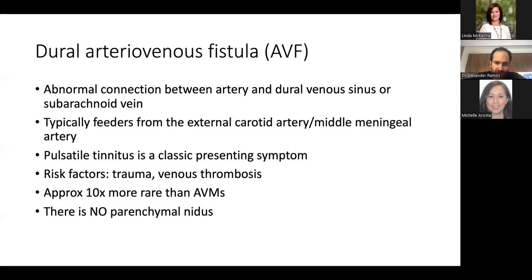For the AVM, we got our catheter way far out, basically into the nidus. So if we shot glue there, the only thing it was going to shoot into was the nidus, so we know that it's relatively safe to give glue there, number one. And number two, you have to have a certain size of catheter to take a coil, and the catheter that we had to bring out that distally, you can't fit a coil inside a catheter that small. So that's why we use glue. Number one, because it's safe, and number two, because we needed to use this specialized, very tiny catheter to get far out there.